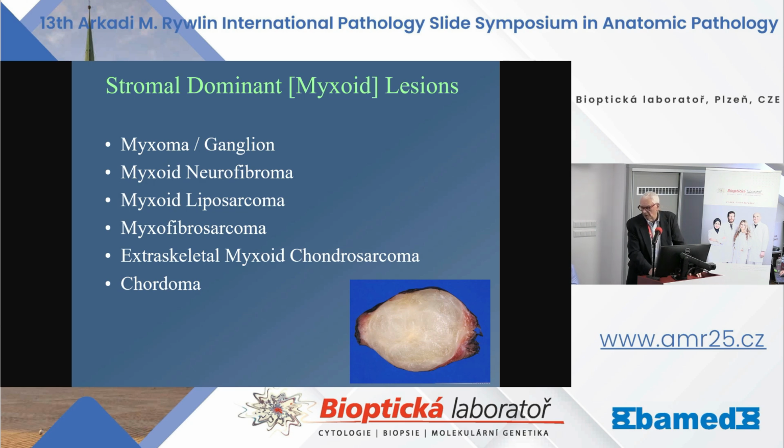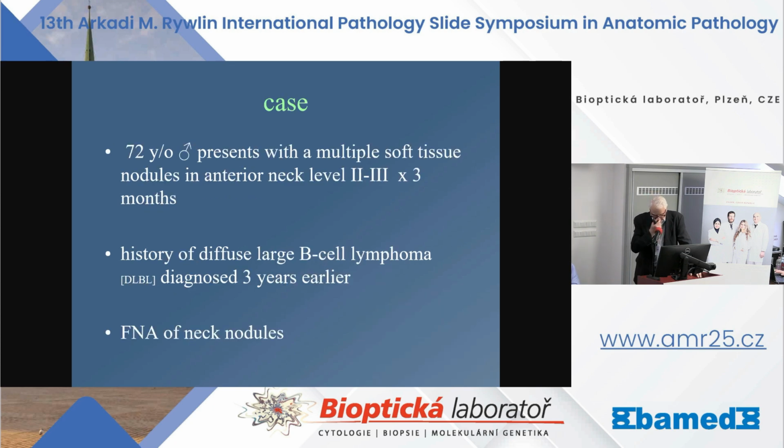Let's look at stromal lesions or stromal dominant lesions, particularly those that are myxoid. These are just some of the entities. It's not a complete list by any imagination. Let me show you a case presentation. This is a 72-year-old man.